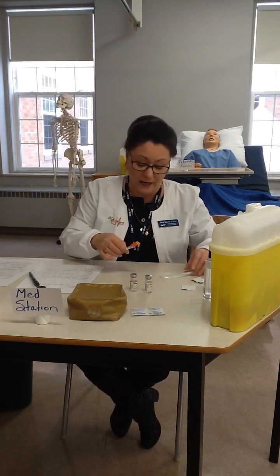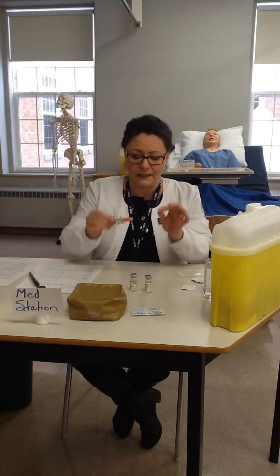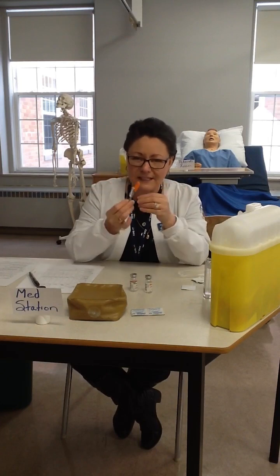I'm getting ready to prepare my medication now. So again, we're working from a vial. That's a closed system. It's under negative pressure. And so we're going to have to add air to our vials before we draw our medication. And so we just work in reverse. We want to stick this sharp needle in the vials the least amount of time so that it's nice and sharp when we go to inject it in our patient. We want to keep it nice and clean and as sharp as possible.